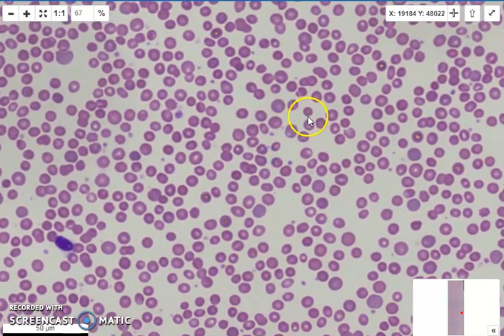And so that is because in our hereditary spherocytosis, the spleen is going to be removing these cells. And sometimes then we would remove the spleen. And so what we could look for in a patient is the signs that the spleen has been removed. So that's our acanthocytes, our target cells, and our Howell-Jolly bodies. However, this patient does not have asplenic features. I do not believe their spleen has been removed.